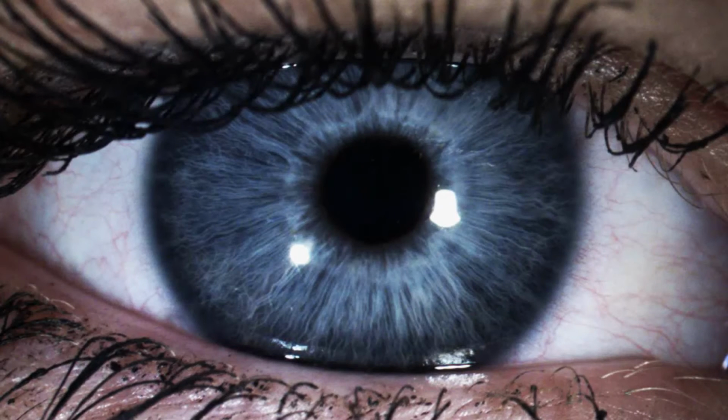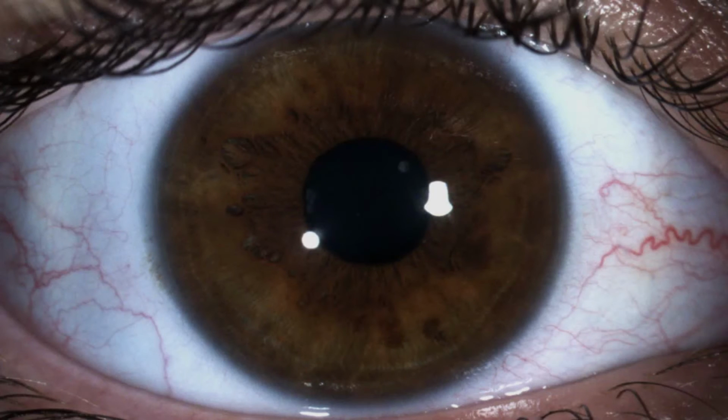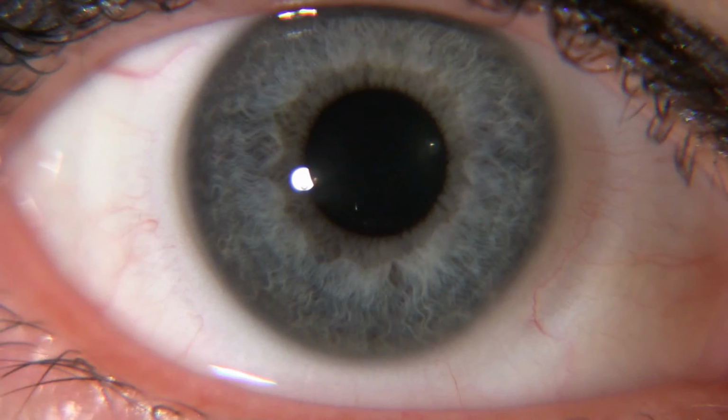After measuring palpebral fissure width, I'll then note the position of the lower eyelid. I describe the lower eyelid in three ways. It's either positioned high, which is above the lower limbus, average, which is positioned at the lower limbus, or low, which means the lower eyelid is positioned below the lower limbus. Having knowledge of where the lower eyelid is placed not only impacts the lens overall diameter, but also the height of the intermediate and near segment powers.